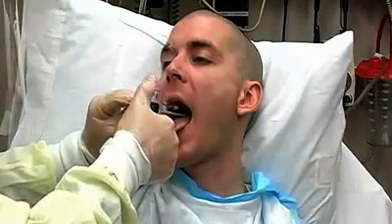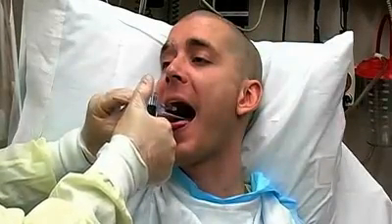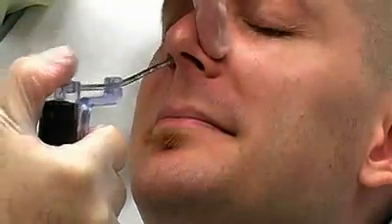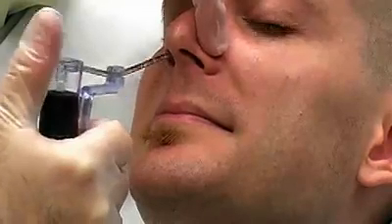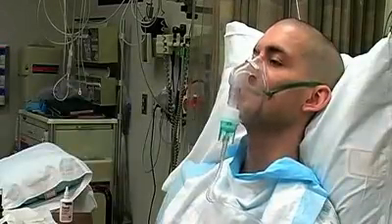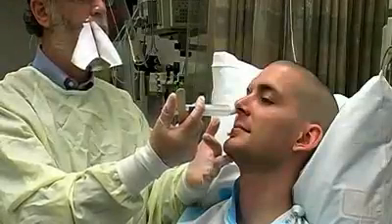Because nasogastric intubation is painful, it's important to obtain good anesthesia by careful application of a topical anesthetic to the nose and throat. There are several options. 4% lidocaine can be applied with an atomizer. 3 milliliters for the oropharynx and 1.5 milliliters for the nasopharynx should be adequate. Alternatively, 4 milliliters of 4% lidocaine can be given by nebulizer. Other options include topical benzocaine spray for the throat and viscous lidocaine for the nose.